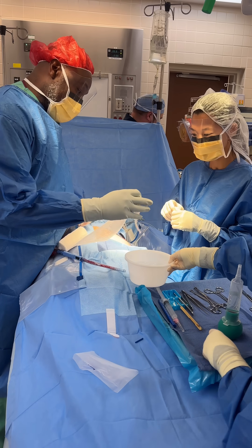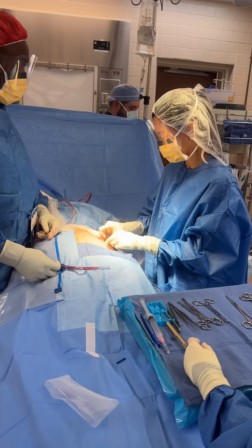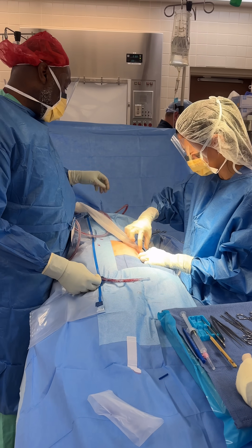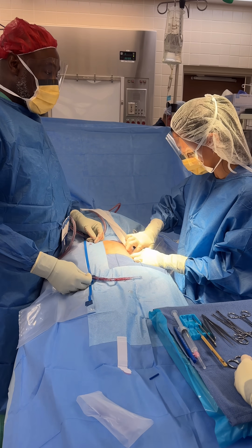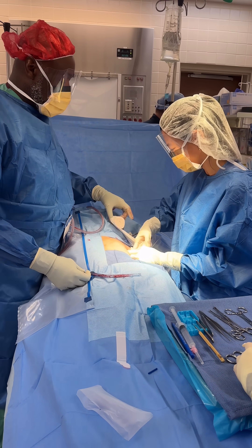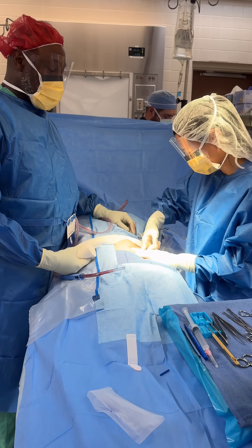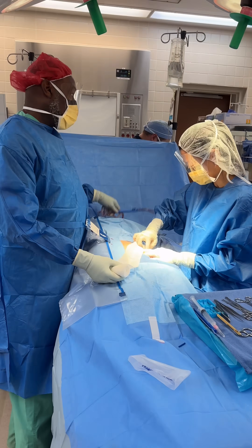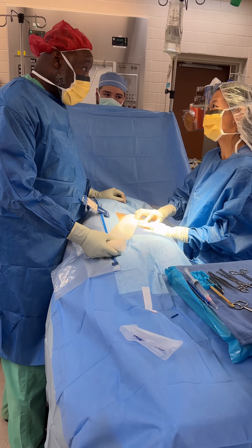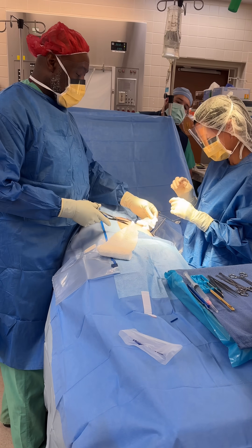Take this, a little bit of it in. Not like that. Pack it in. Yeah, keep going — keep going, keep going, keep going. So then all you do is cut off enough where you can ball it up.